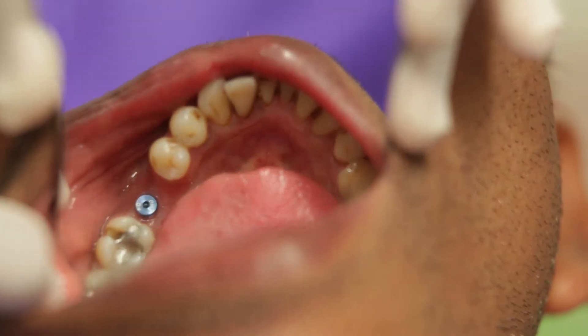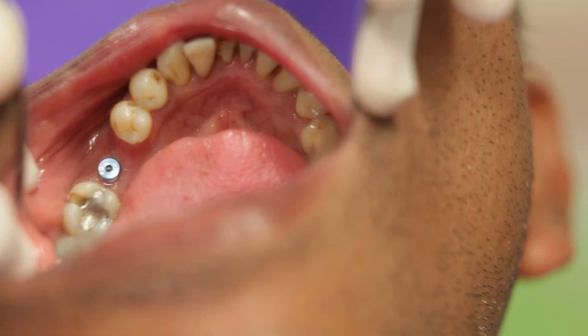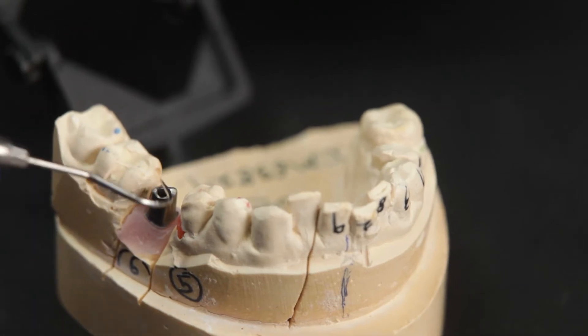This is the case of a lower molar implant where the impressions were done and I now have the prosthesis delivered to me from Illusion Dental Lab. I have ordered a smart abutment for this case, which is a CAD-CAM customized abutment with the highest levels of precision.